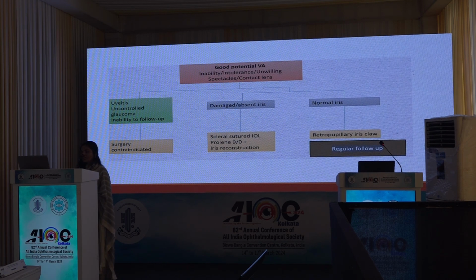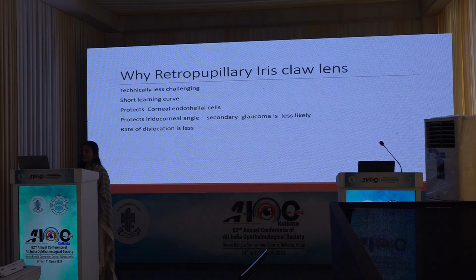Then if the iris is absent or damaged, we can go ahead and implant scleral sutured IOLs with Prolene 9-0 suture, and iris reconstructions can be done. If the patient has any uveitis, uncontrolled glaucoma, or inability to follow up, then surgeries are contraindicated in these patients.